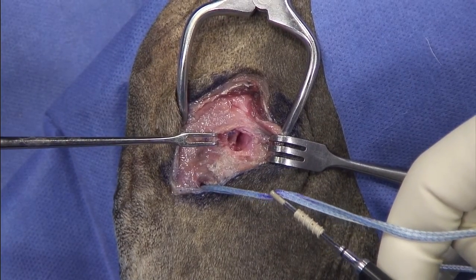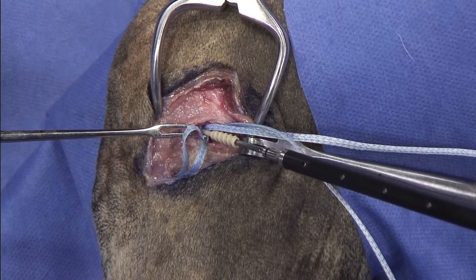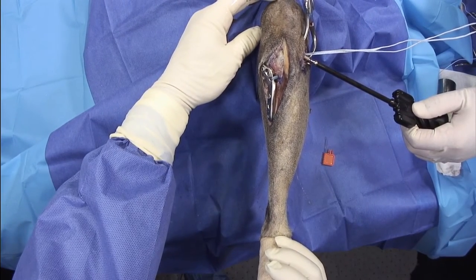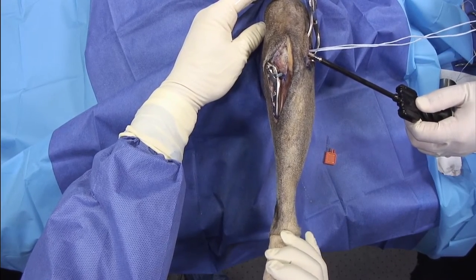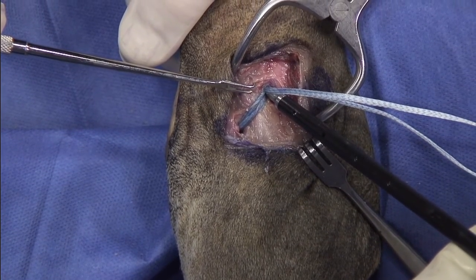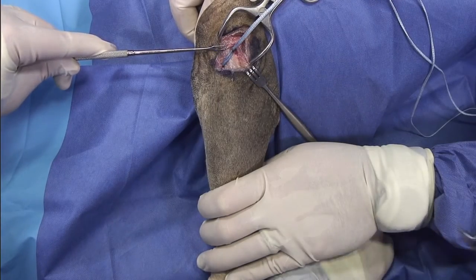Now we're ready for the insertion. We're going to use the mallet to initially insert it. I'm checking the alignment of the tibial tuberosity — I want to be sure that it's in a neutral position, or that I can apply a few degrees of internal rotation. As you can see, we've just embedded the laser line, so I'm happy with where we are.